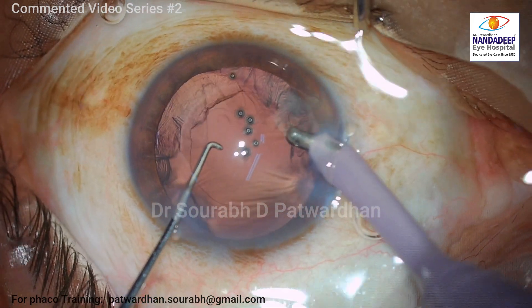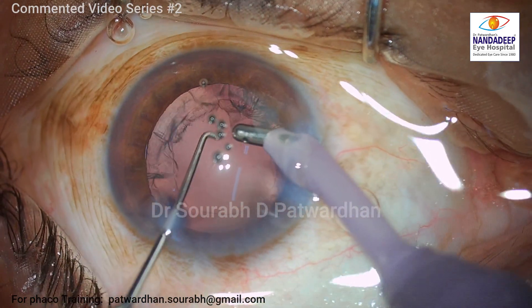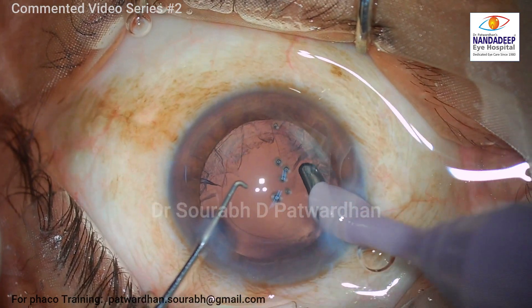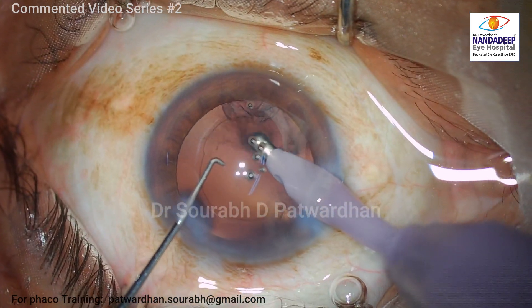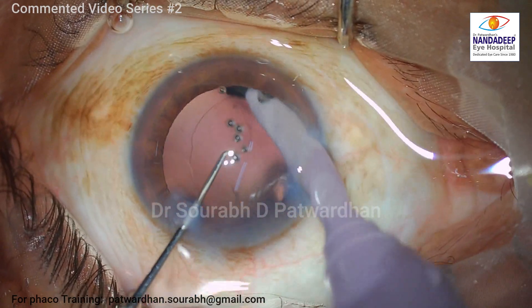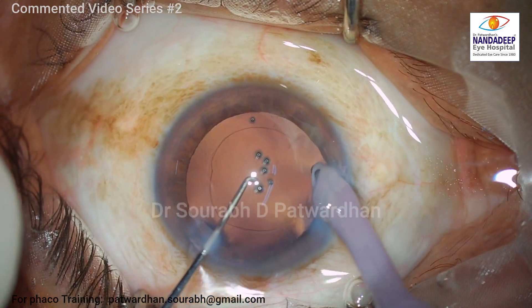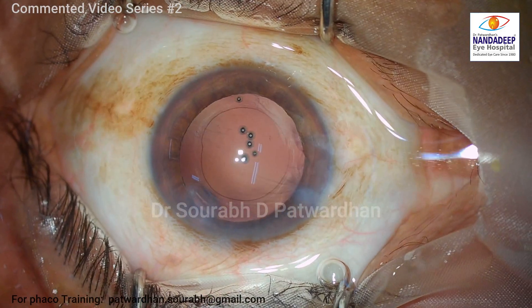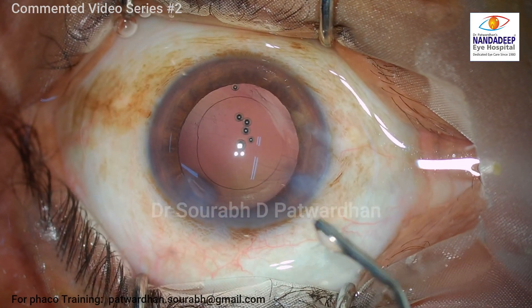As I start the coaxial irrigation-aspiration, as soon as the infusion starts, you can see there is again a reverse pupillary block. The patient felt a little bit of discomfort, and I released it by lifting the iris. Once that block is released the patient is more comfortable. Due to the initial rotation of the nucleus, you can see that there was hardly any cortex remaining, which was cleaned off very easily.